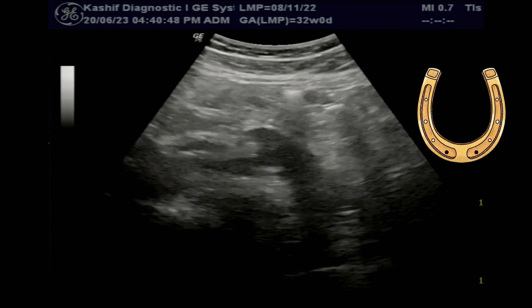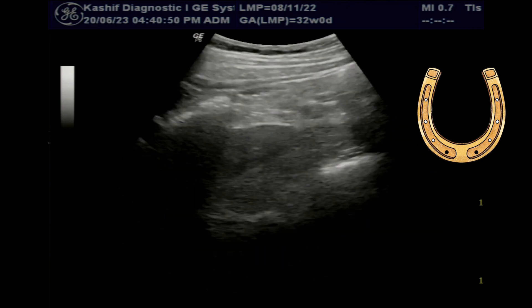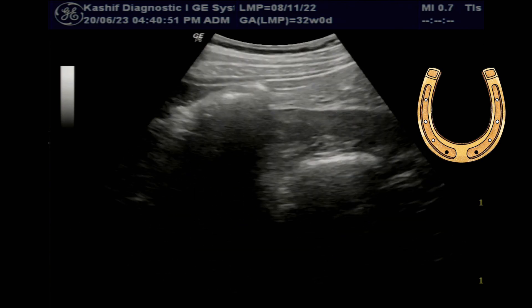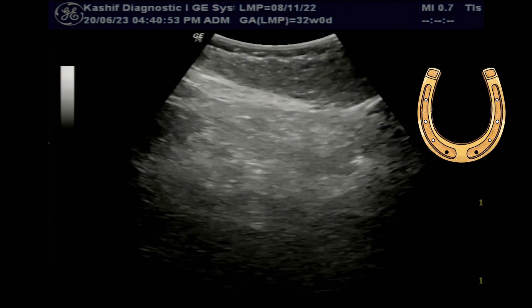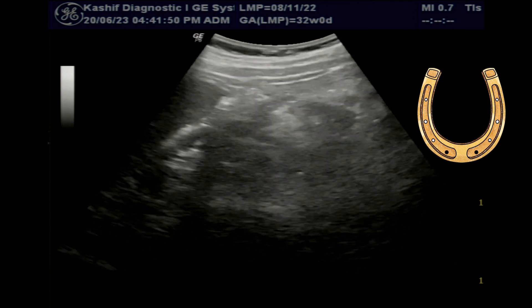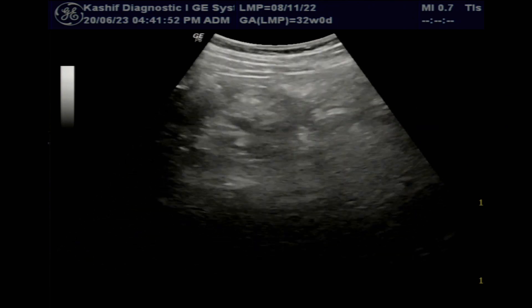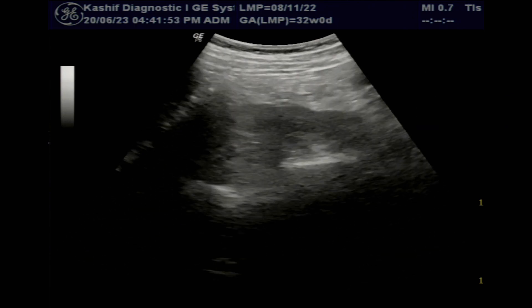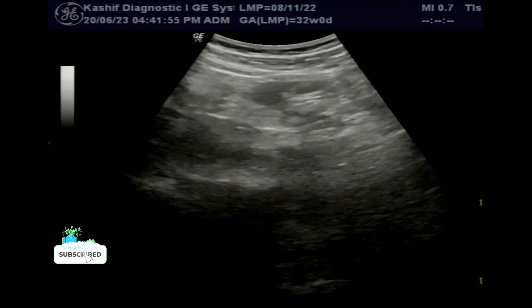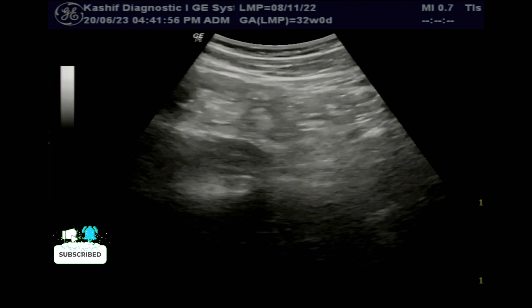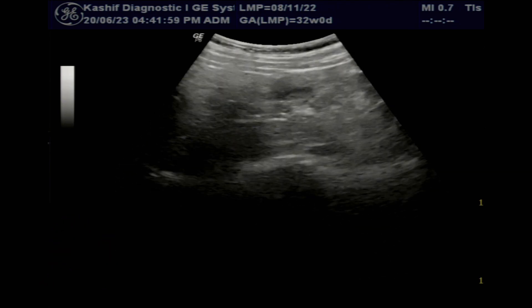This is horseshoe kidneys. These are the most common fusion defect of the kidneys, affecting about 0.25% of the population. By fusion of the lower poles, this gives a U-shape, which gives it the name horseshoe kidney.